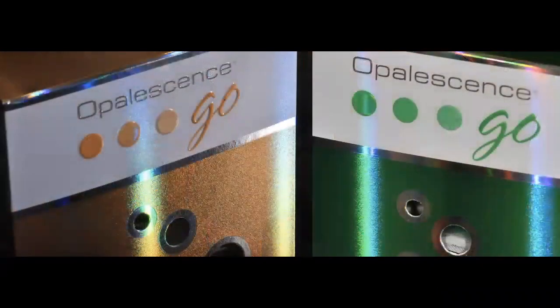The higher concentration is just to make sure that I have more product, more hydrogen peroxide available for the bleaching. Because these teeth were more saturated, yes, I do want to have a higher concentration. But if I find that this is a younger patient and I have any risk for hypersensitivity, I'm always going to go with the 10% carbamide peroxide, even if I have to extend the treatment more than 15 days. When you have patients with hypersensitivity, they just don't follow the treatment the way they should.